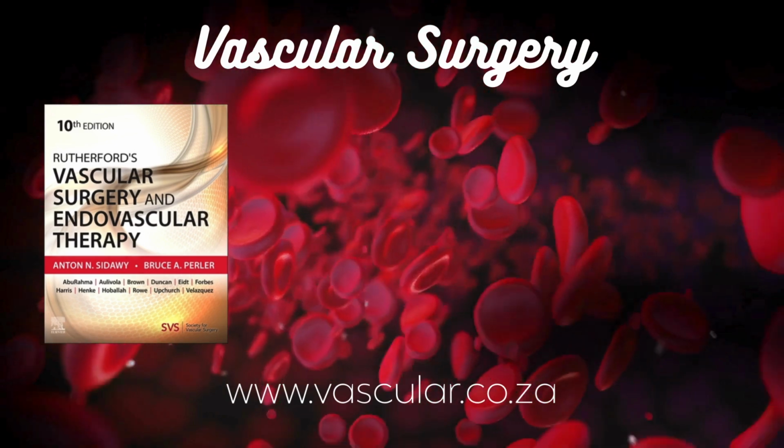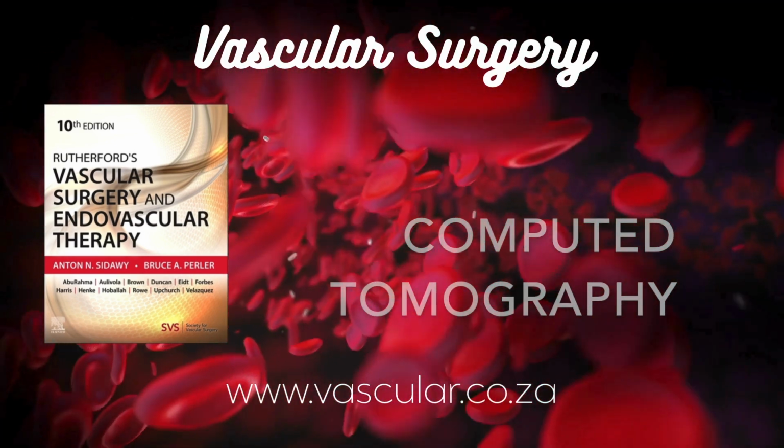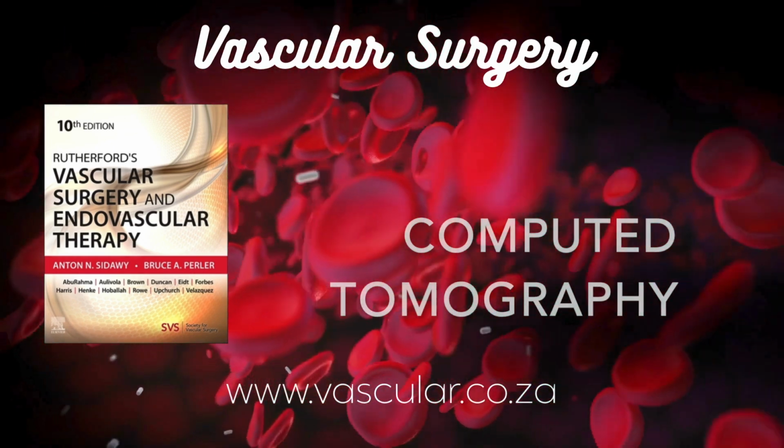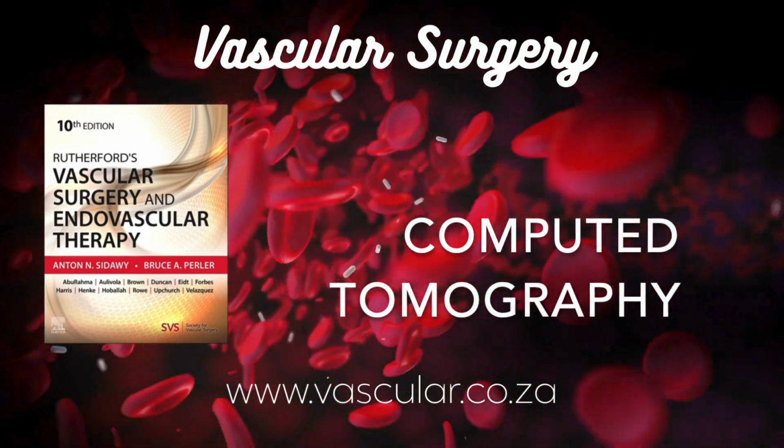Different metals cause different amounts of artifact. Tantalum and gold are often worse than steel or platinum. Interestingly, tantalum and gold cause minimal artifact on MRI. You mentioned beam hardening from contrast too.